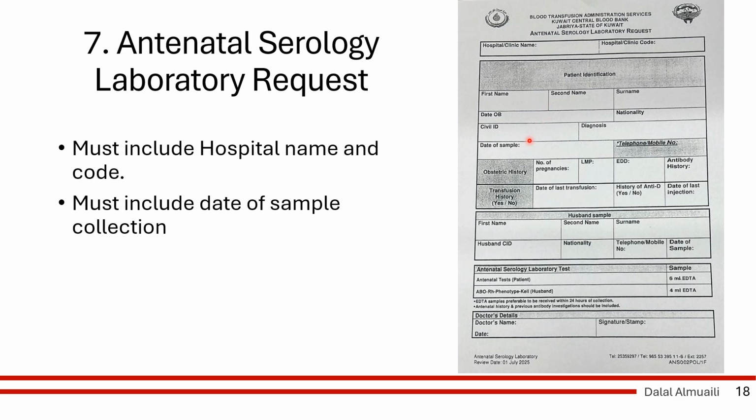It is also very important that you fill out the patient information very carefully. You cannot use correctors, for example. You cannot erase some of it and then write on top of it. It either doesn't have any of this, or if you cross out something, you need to put in an initial next to it and then clearly write underneath it the correct information. Those details will vary slightly from one country to another.